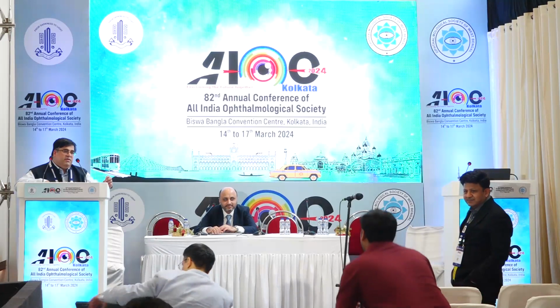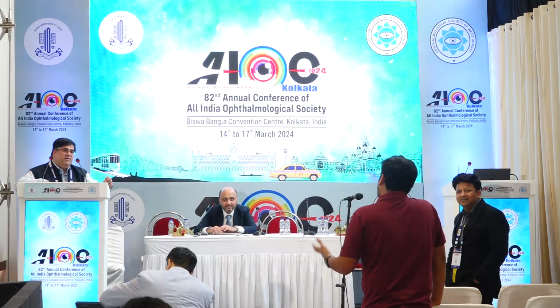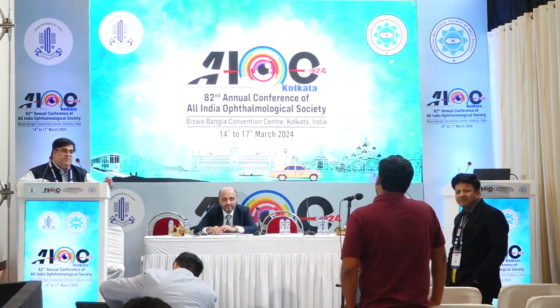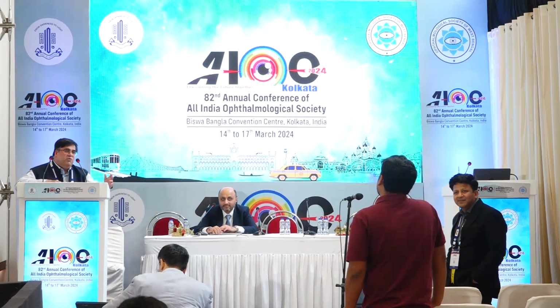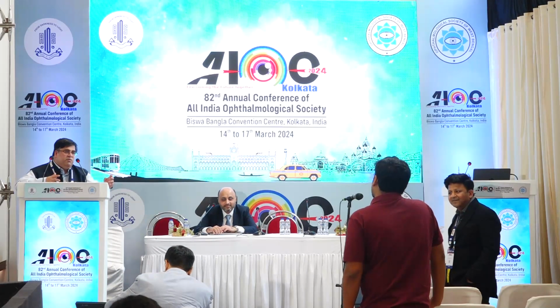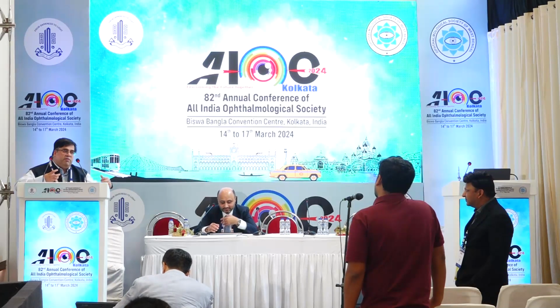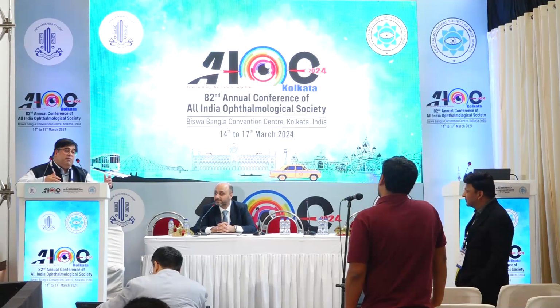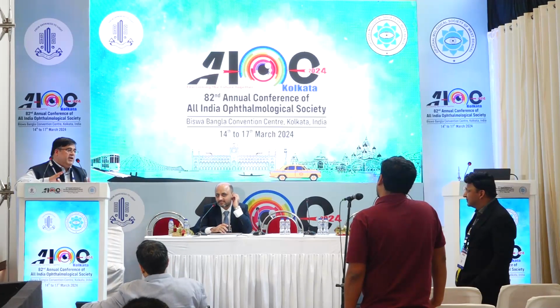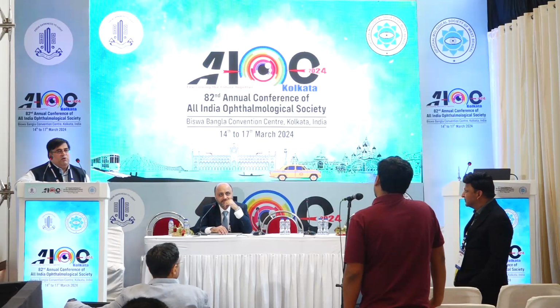There was 1 case where I waited for 1 month. I thought the blood was getting clear, but after 1 month, the posterior pole looked very bad. So 2 weeks is generally, before it starts to become yellow, I'll go in, and if it doesn't move away from the fovea, you can make out. As you follow up this patient, you can see whether the quantum of blood is coming down, or is it displacing inferiorly. I'll be very happy if I see a streak hyphema coming in. I know the blood is getting pushed more anteriorly. But if not, at 2 weeks I'll go in.